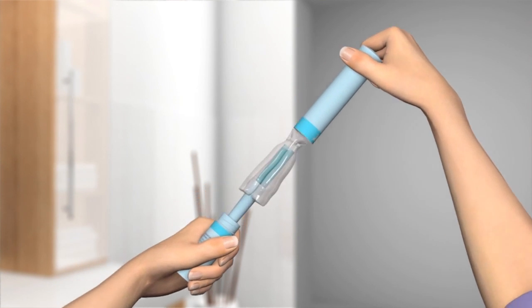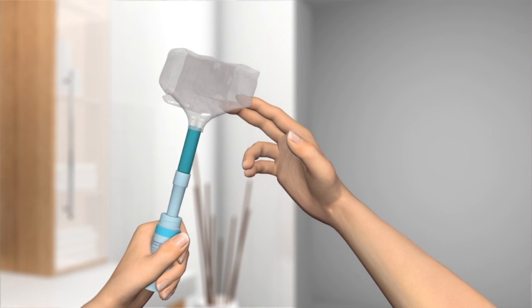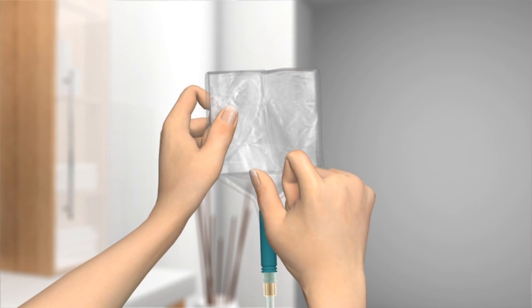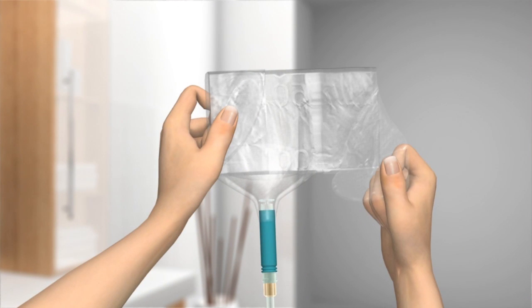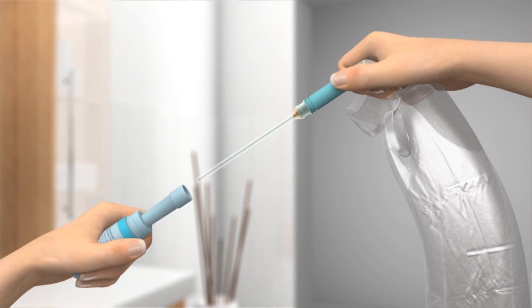Twist to open the tube and remove the lid. Unfold the bag. Twist and pull the catheter out of the tubing. Now it is ready to insert.